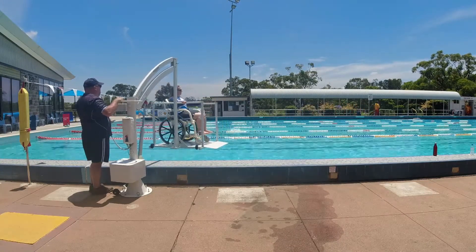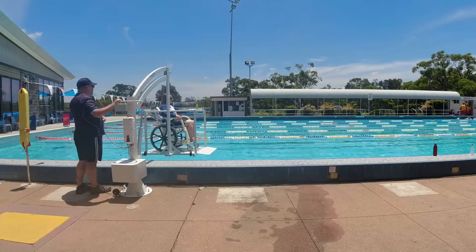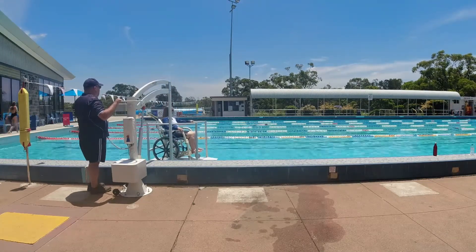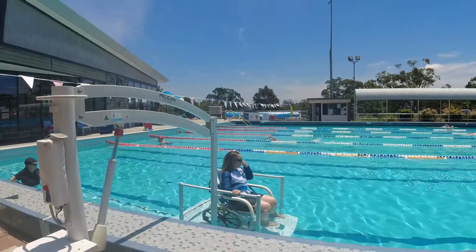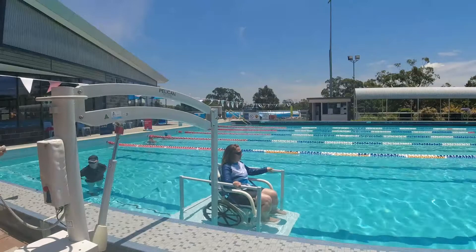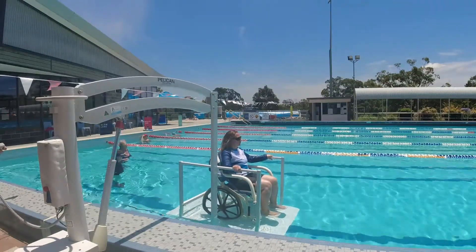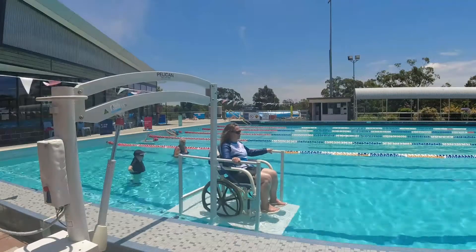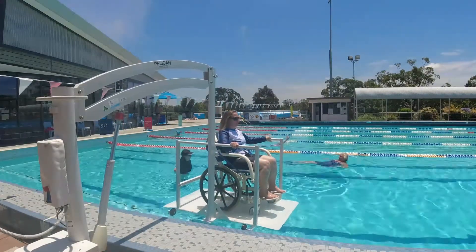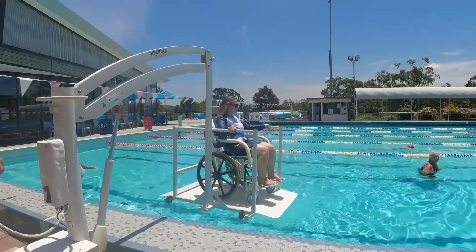This is to ensure safety and workability based on their needs. It's also important that the aquatic chair seatbelt and wheel locks are used when poolside and during entry and exit transfers, again for safety around the pool. It's normal for the platform to be lowered to the pool floor; however, if used in deep water this isn't essential as a person may be able to swim off with or without assistance and return accordingly.